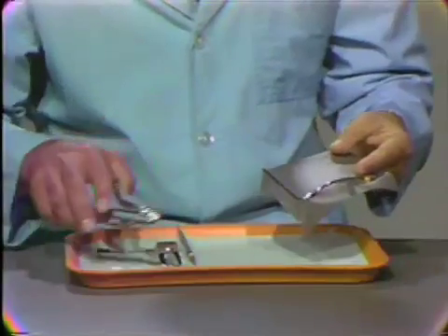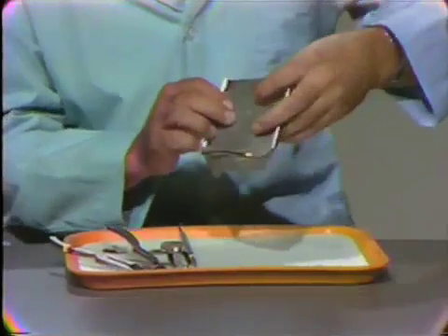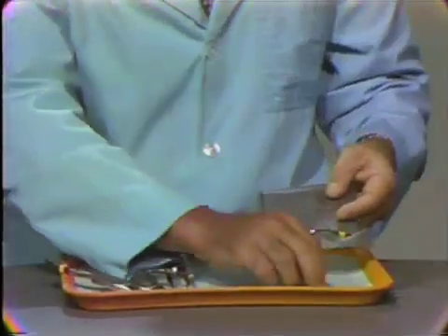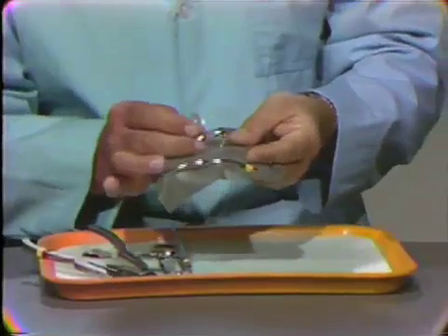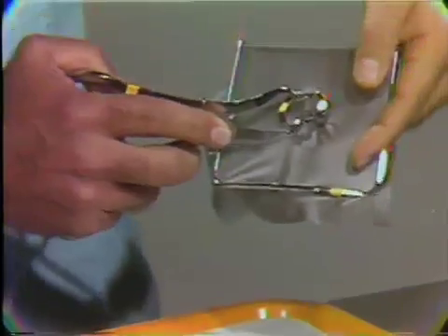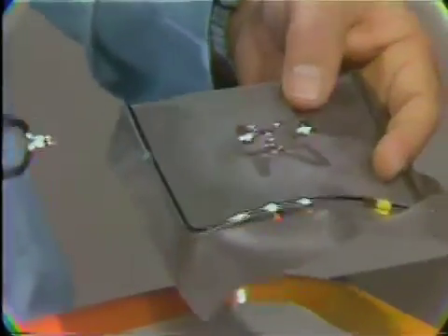There are different ways of placing the rubber dam on the tooth. One is to transport the dam to the patient and slip the hole over the tooth to be isolated. The other method is to take the clamp, place the wings of the clamp on the rubber dam, place the rubber dam clamp forceps on the clamp, and transport this mechanism to the tooth to be isolated. We will now move to the patient and demonstrate the placement of the rubber dam.